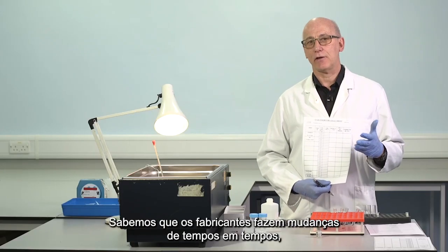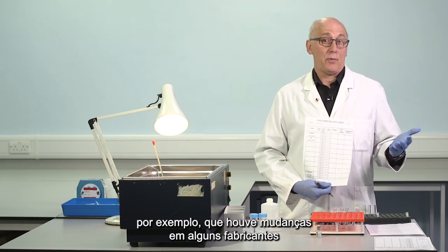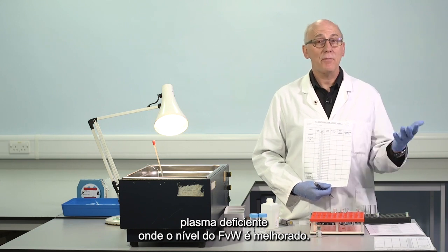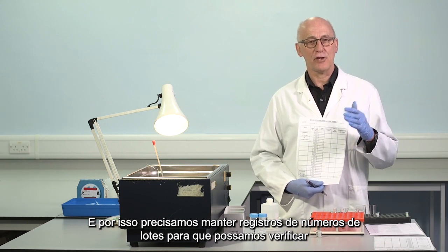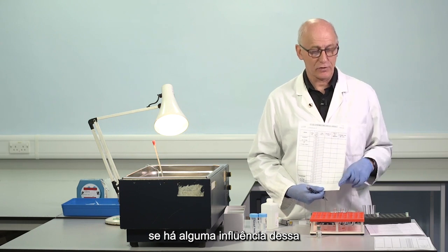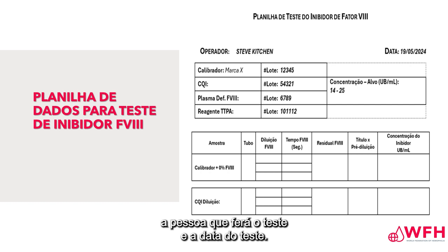We know that manufacturers make changes from time to time. For example, there have been changes in some manufacturers' deficient plasma where the level of von Willebrand factor is improved. And so we need to keep records of lot numbers so that we can check back to see whether there's any influence of a change over such a lot number change. The person who did the test and the date of the test. And you can also see a number of boxes here.